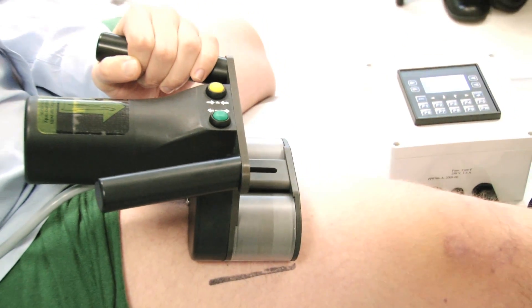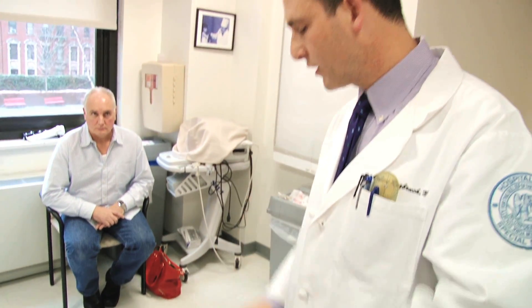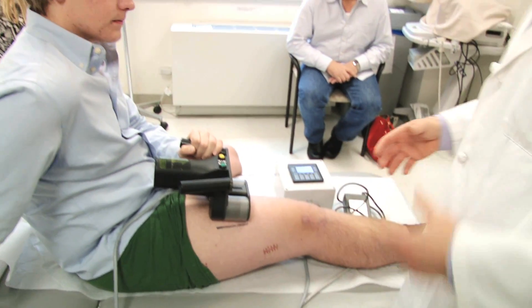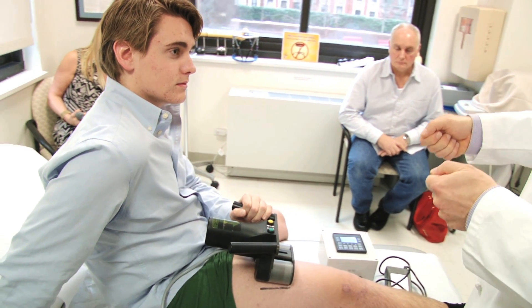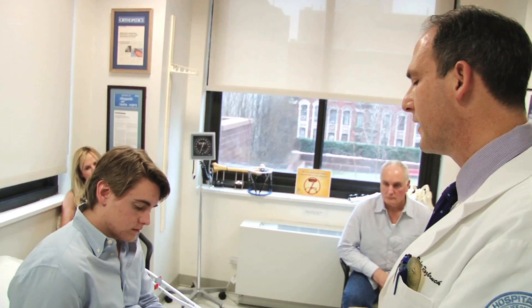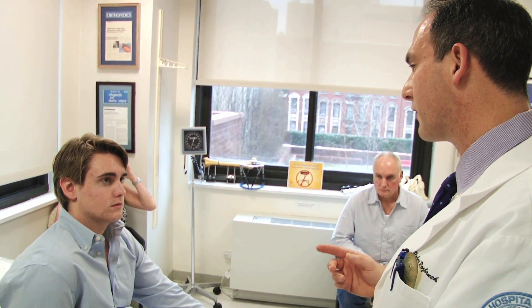The magnet has a depth of penetration of about three inches. If we're using it on the leg bone, which is very thin, there's no problem. But when using it on the thigh — especially on a muscular guy like you — you want to make sure you put a little pressure on it so that you get it closer to the bone, which is in the center of the leg. It takes about seven minutes to do a millimeter. We want you to do a third of a millimeter three times per day — a seven-minute treatment divided by three, so about two minutes and 20 seconds. It will automatically shut off.